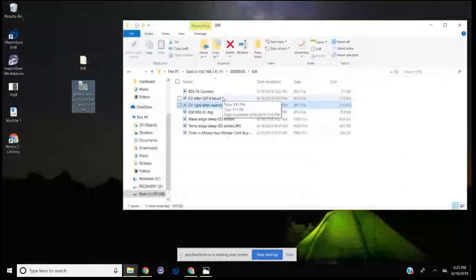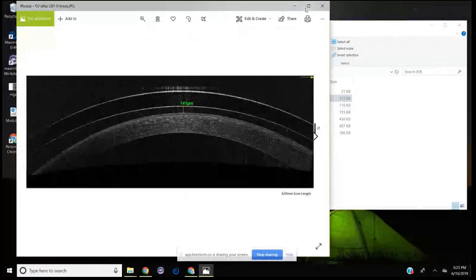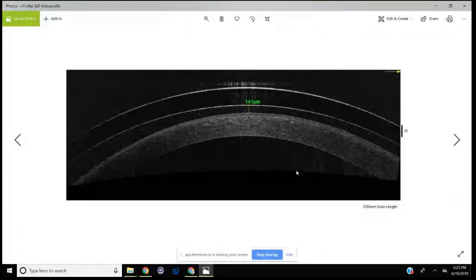So I ordered the lens exactly as Eaglet described, and this is what I got. One caveat, this lens is the ordered lens with the haptics built in. You can see the centration is far superior. Not superior in terms of display, it's just better. That lens looks much more centered on the eye. The vault, this is after 8 hours. This was the design lens after the patient wore it.